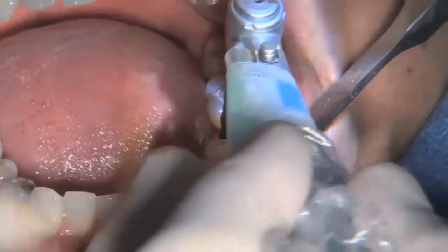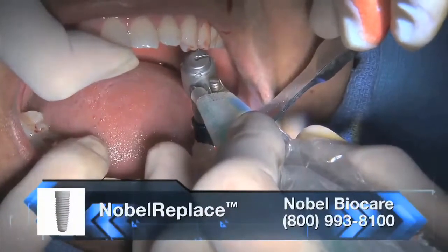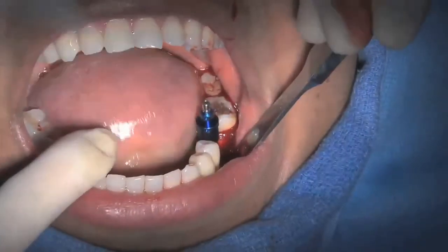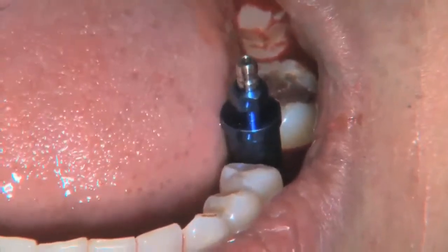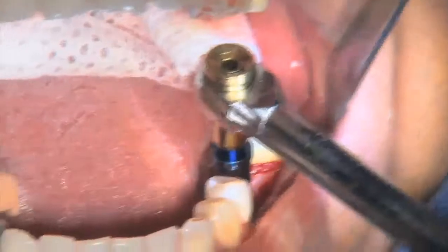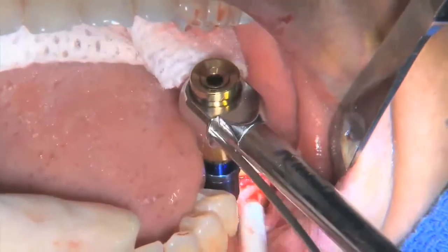And then using very low revolutions, the implant is brought to place. In this instance, we could have placed the implant through the surgical guide, but in this case, with an open flap procedure, I could readily visualize the placement of the implant, and just for expediency's sake, did not use the guide. Utilizing the torque wrench for final seating will provide better control as well as provide feedback on the primary stability of the implant. The torque should not exceed the implant manufacturer's recommendation.